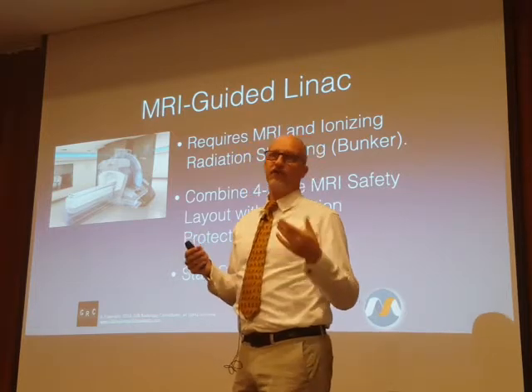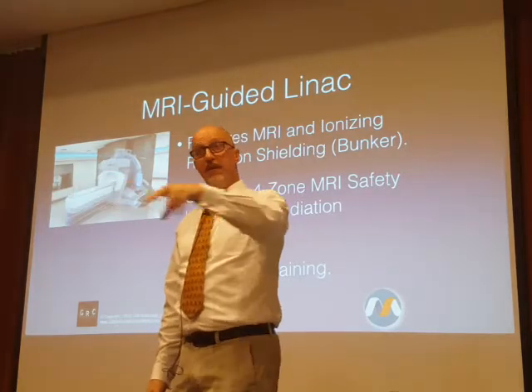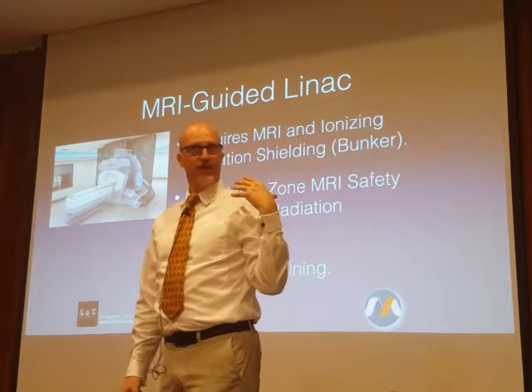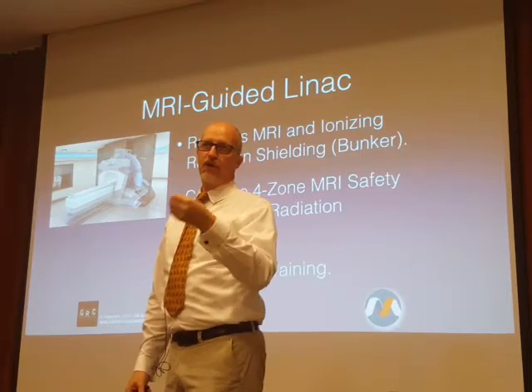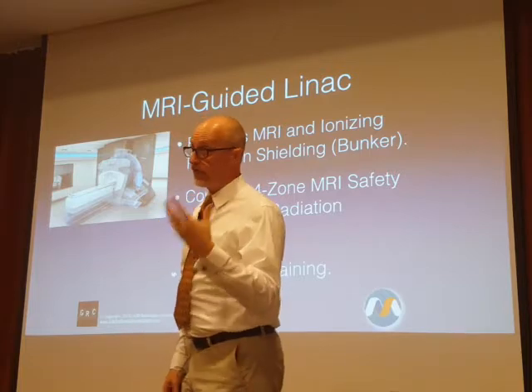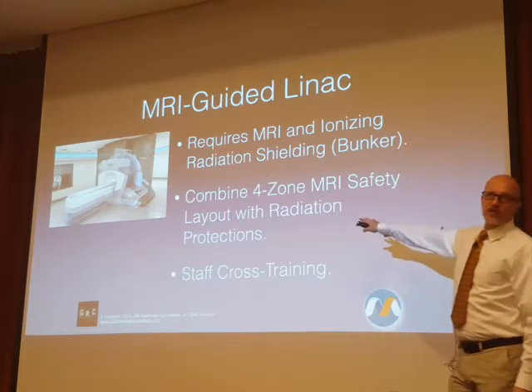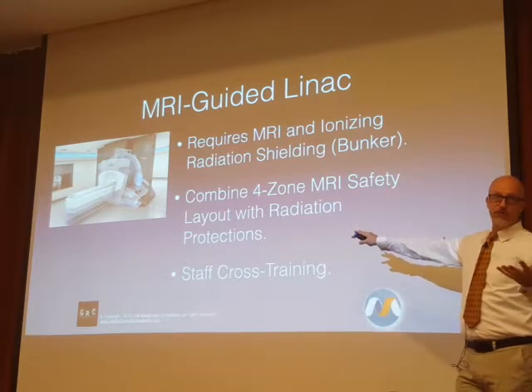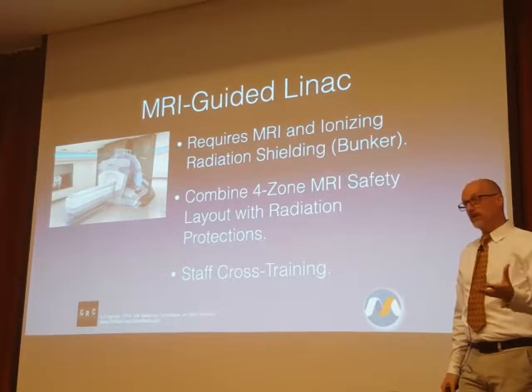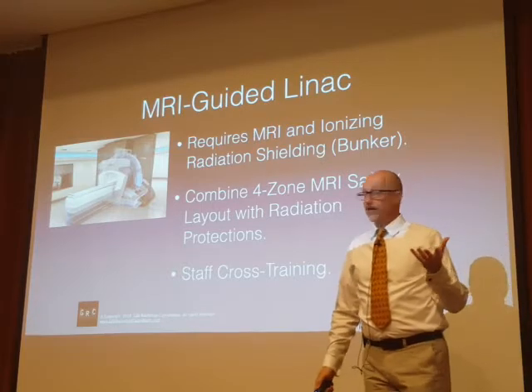The good news is, unlike PET MRI, where we have significant patient preparation before the patient comes into the exam room, for linear accelerators, there's not an awful lot of patient preparation. We don't have to deal with radioactive materials like we do on the PET side. So while there is some coordination in terms of the 4 zones and radiation protection, this is actually an order of magnitude easier than the PET MRI is.